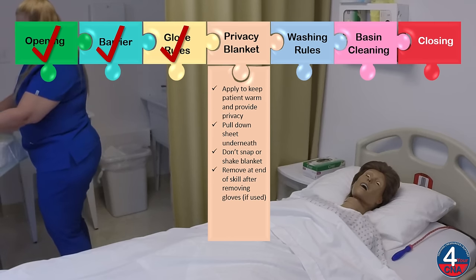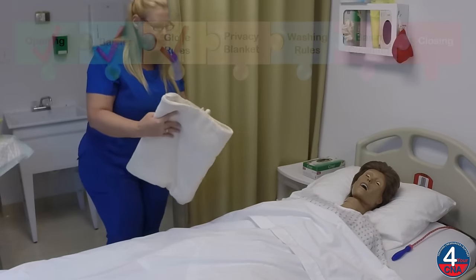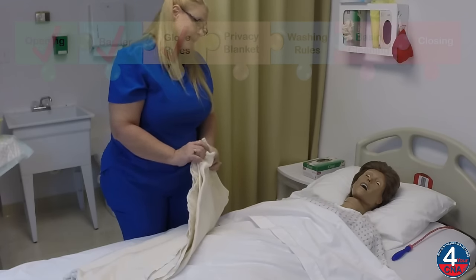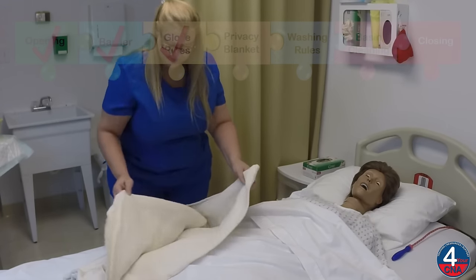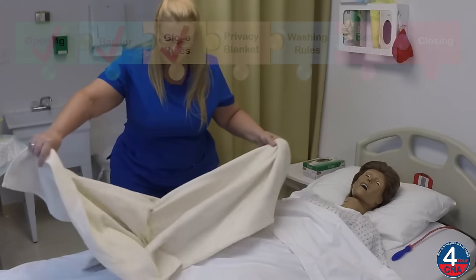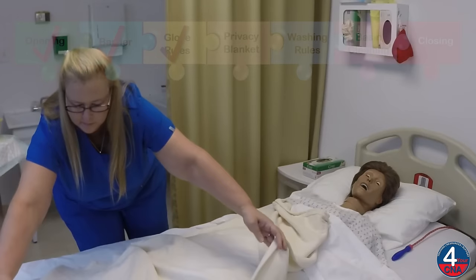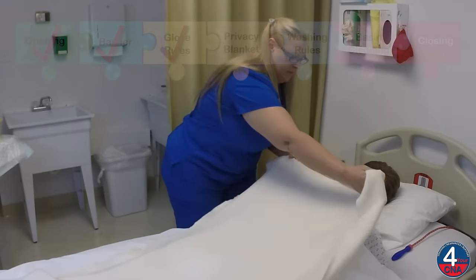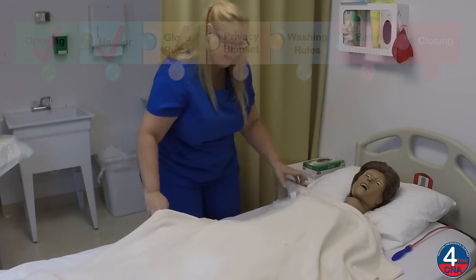I'll place the washcloth in there to stay warm, and I'm going to cover you with a privacy blanket. This is going to help protect your privacy and keep you warm while we do this skill. And I'm going to pull your sheet down to about your knees.